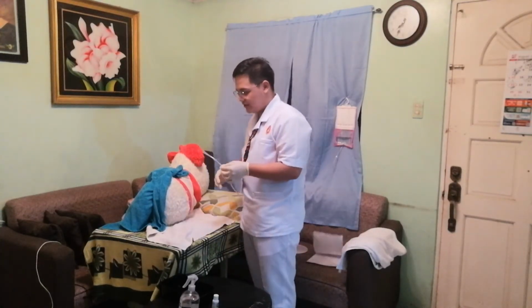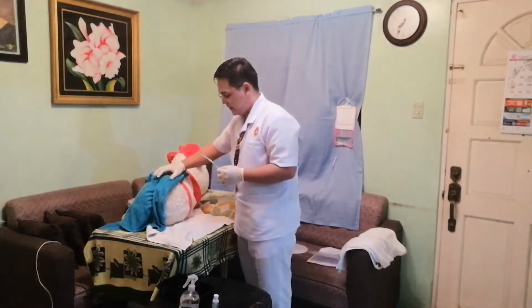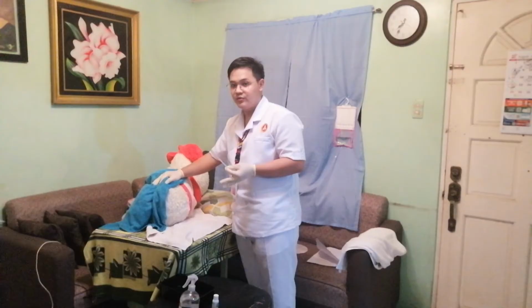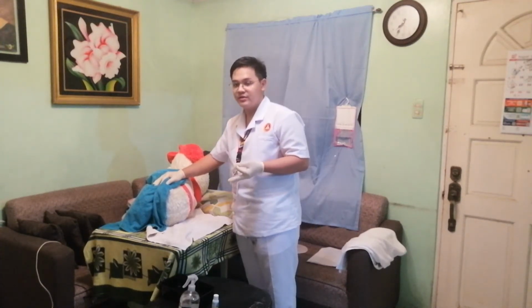Okay, now that we got the tube, so let me remind you that this tube is still clamped or closed. We will be inserting the tube now. Okay, so we will be inserting it slowly and smoothly to the patient's rectum. And to do that, we will need to insert it for about 7 to 10 centimeters.